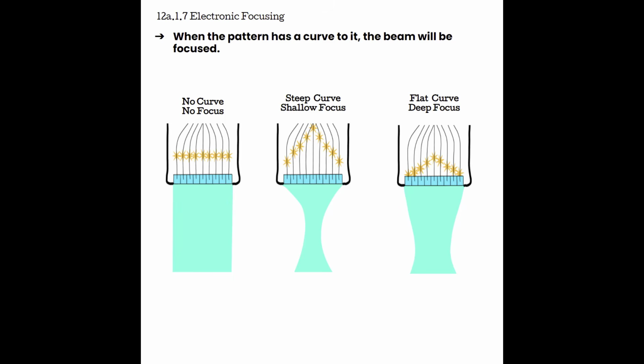The multi-focus fixed transducers are mostly obsolete, so we're going to spend a little bit more time learning about electronic focusing, which is how most of our transducers on our modern systems are going to operate. Now, electronic focusing is based on the fact that we have an array transducer, so we have multiple crystals, we have a wire attached to each of those crystals, and we can send a pattern of electrical voltages down to those crystals. So again, electronic focusing is only possible with array transducers.